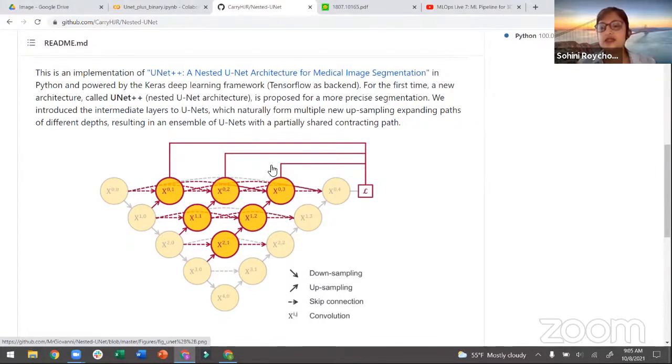And the concept behind it is exactly the same as that of ResNet. It says if you take the previous layers and concatenate them along with an intermediate layer, then there is more information that comes from the previous layer to this one. So if there was any vanishing gradient problem, then that ideally would be taken care of.